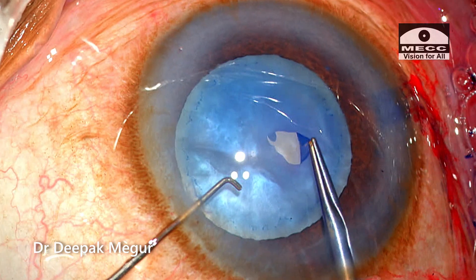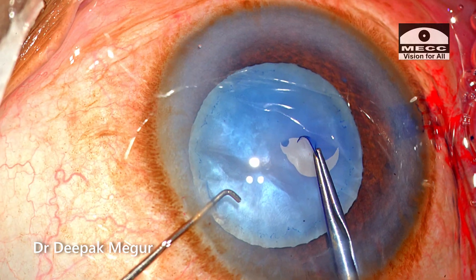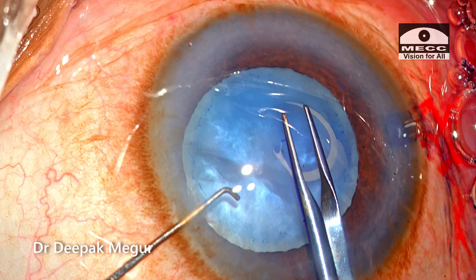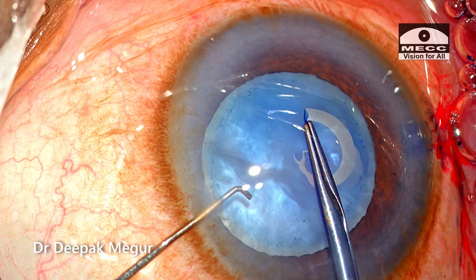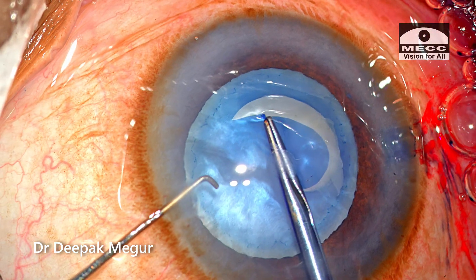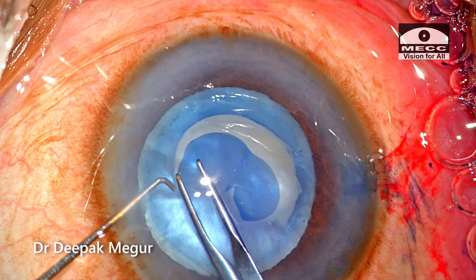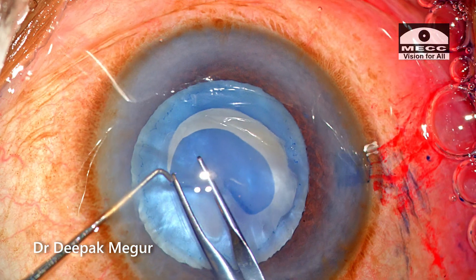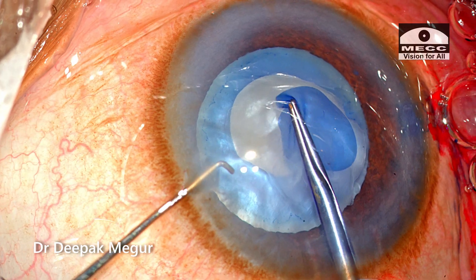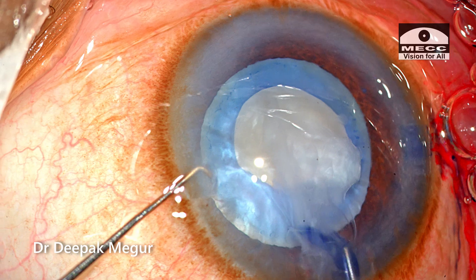As soon as I grasp the flap and try to tear it, I can suddenly feel the extreme desire of the capsule to run peripheral. So immediately I keep the flap and pull it centrally and repeatedly. I'm trying the pull-in technique and the rhexis is coming back, but with a lot of reluctance. The key in this situation is never to fold the capsule — use the tearing method rather than shearing. The moment we fold it, it's going to run out.